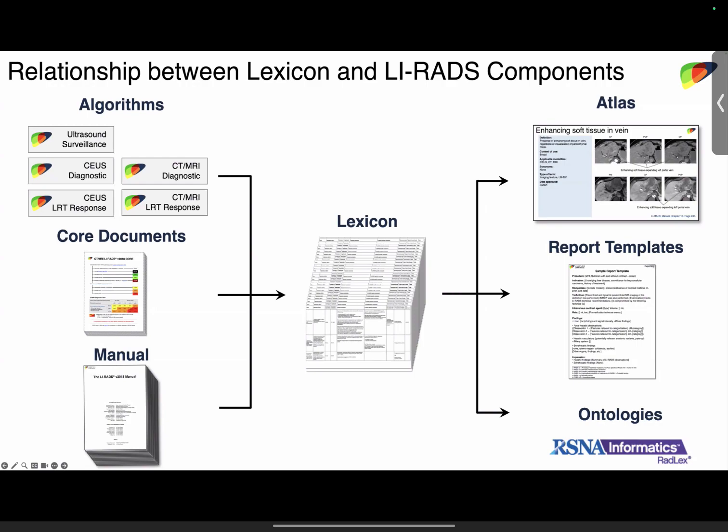Also notice that the lexicon is embedded, it is used throughout the report templates. Also, early versions of the lexicon, as well as future versions of the lexicon, will be embedded in ontologies, such as the RSNA informatics ontology known as RadLex.